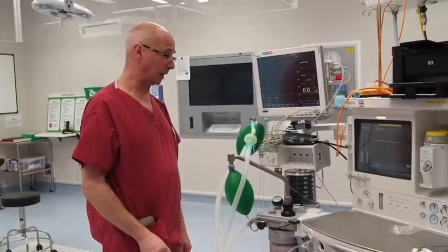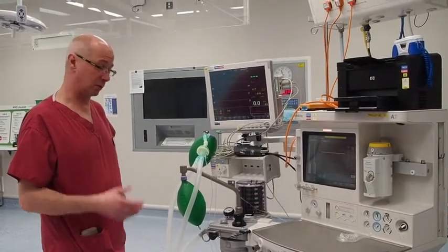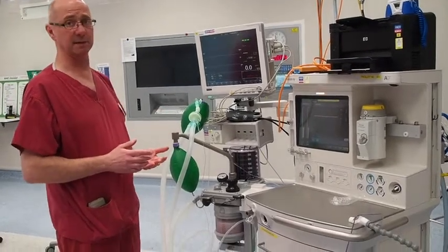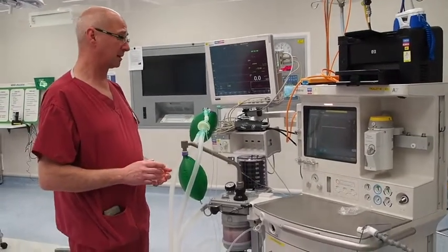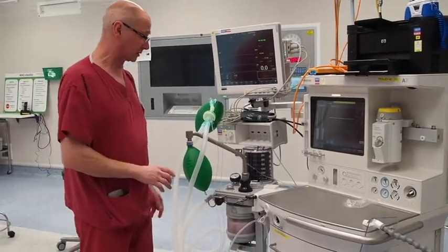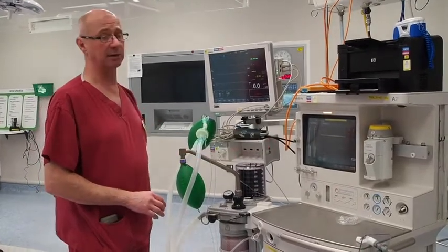Okay, I think that's really all I want to say. We're all available if you want to have a chat, and you won't be left with these machines to start with, but hopefully it's just demystified them a little bit. They are really quite simple once you get used to them, but the circle side does take a bit of getting your head around when you start. And the secret is keep the flows high until you get familiar with them.